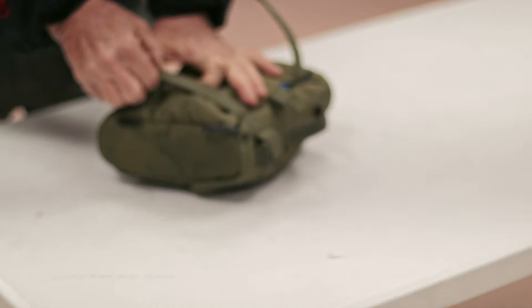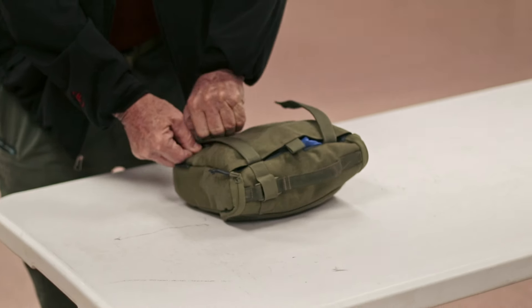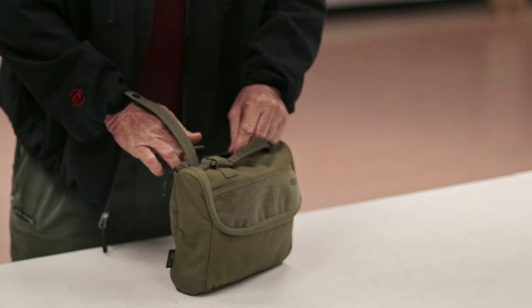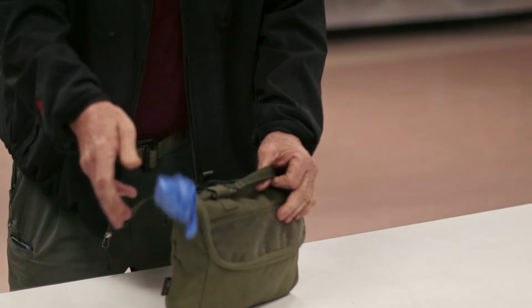I can get it out by pulling these straps off — it's just easier to pull the straps off. So in here I've got a pair of gloves on the outside, I've got an NPA which is for clearing the airway.